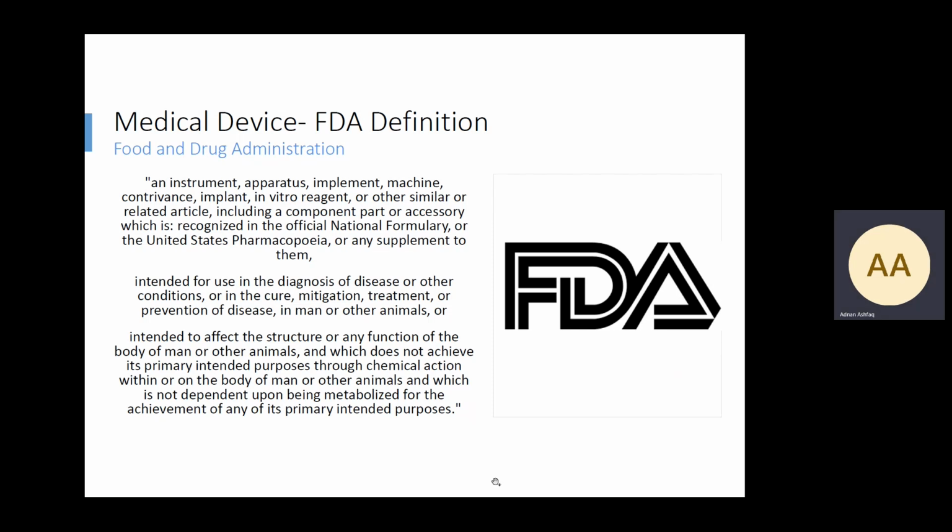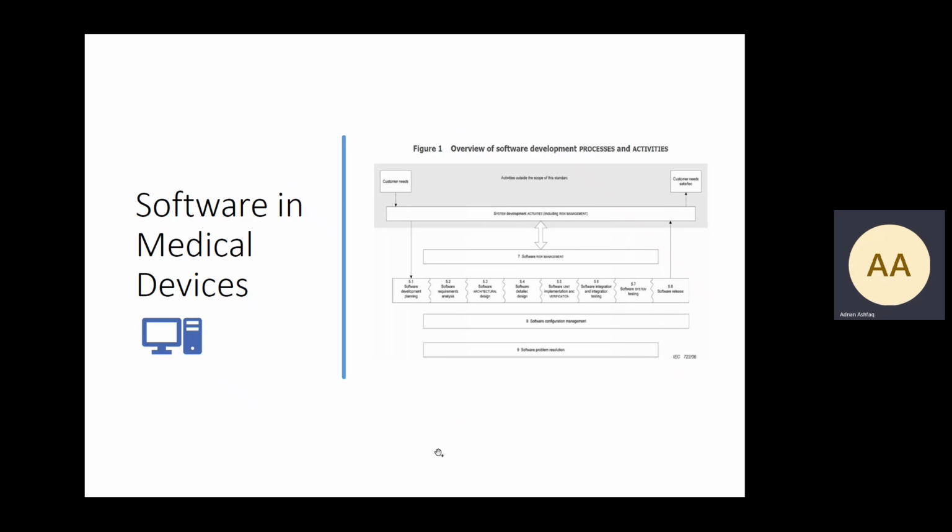And I would also say that the wording from the European regulation that I just showed in the previous slide is very carefully worded, and it almost or entirely, in my experience, covers every potential angle that a medical device developer would face if the product is a medical device, and it then becomes very difficult to avoid because of the terminology used in the previous slide. And it's perhaps something that the FDA need to tighten up and improve on the definition because of these changes in technology. So let's move into the 62304 standard.